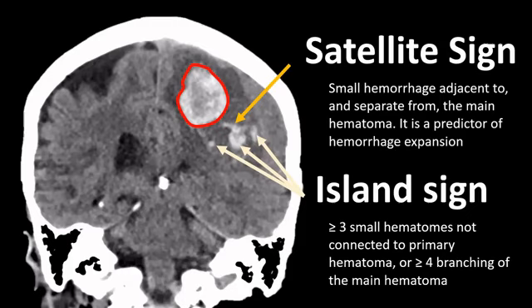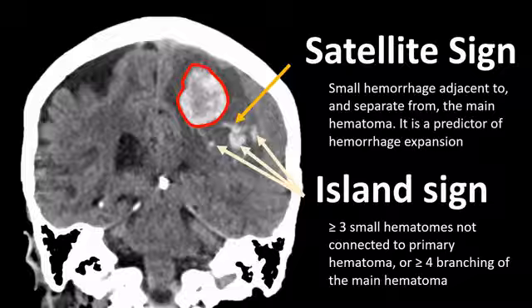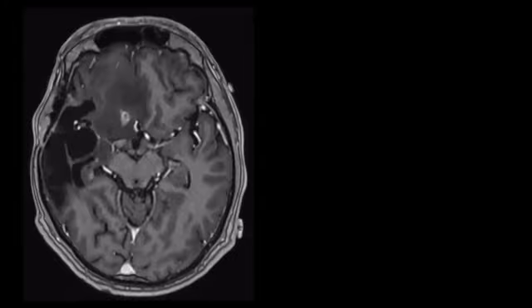But if you ask me, we have also entered a bit the world of the ridiculous, because we have to start looking at how many hematomas or how many sprouts we see, and we're starting to analyze this quantitatively. And this is not a true sign, in my opinion, despite the fact that they have given it a sign name. But once again, just me, personal preference.